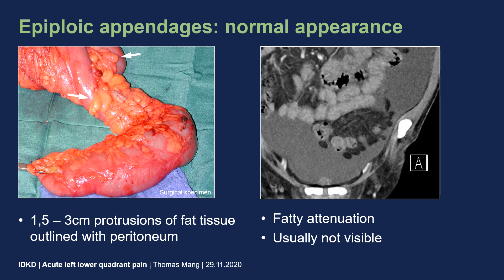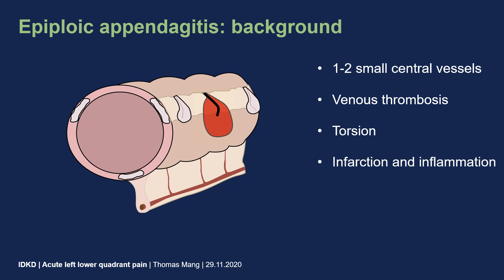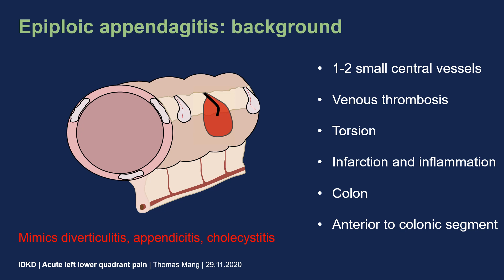Here is another example showing multiple epiploic appendages from the sigmoid colon surrounded by intraperitoneal fluid. Within the epiploic appendages there are one or two small central vessels. There may be either venous thrombosis of these central vessels or torsion of the entire epiploic appendage, finally leading to infarction and inflammation. Epiploic appendages may occur in any colonic segment, most commonly within the sigmoid colon, and are typically located anterior or anterolateral to the adjacent colonic segment. Clinically it mimics diverticulitis, appendicitis, or cholecystitis.